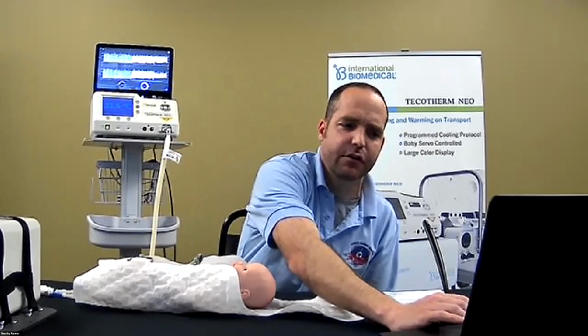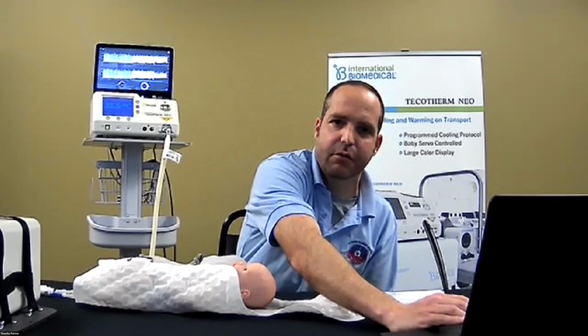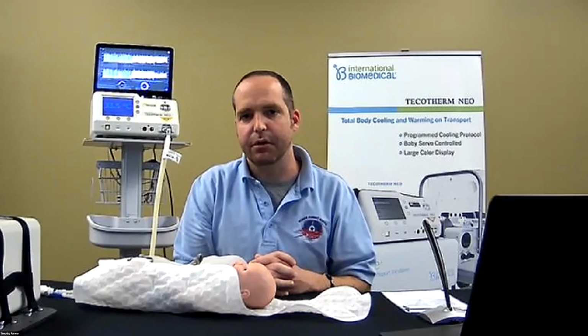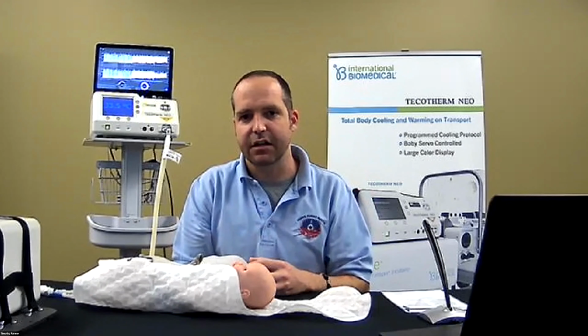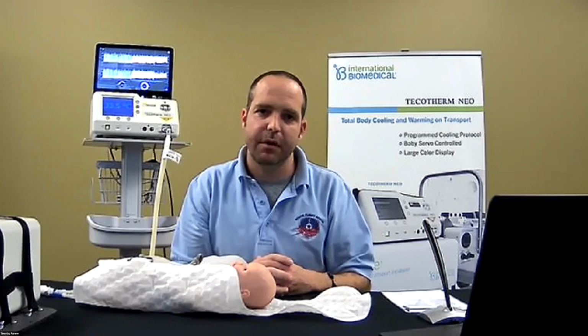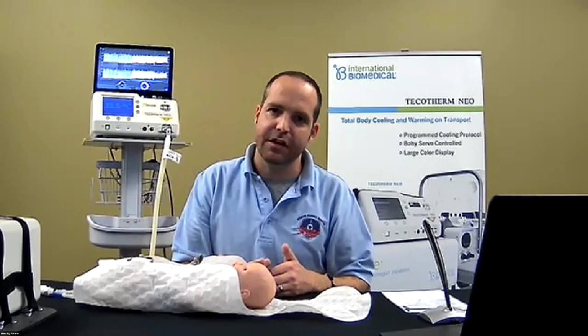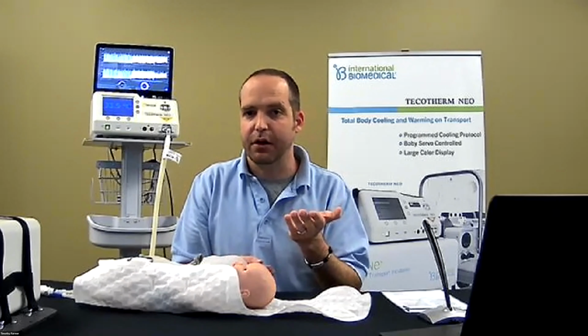Another thing we're really happy about is that we did a lot of work with passive cooling at our referring facilities. So, the patient's been targeted for potentially therapeutic hypothermia, we're on our way, and we ask them to do these types of interventions to maintain the patient's temperature and reduce the heat on the warmer. Sometimes patients would be a little too cold, or a little too hot. For those that were a little too cold, when we got there with our Tecotherm, we could slide that mattress right underneath the baby as we were preparing for stabilization and get the baby warmed up quicker to that therapeutic temperature.